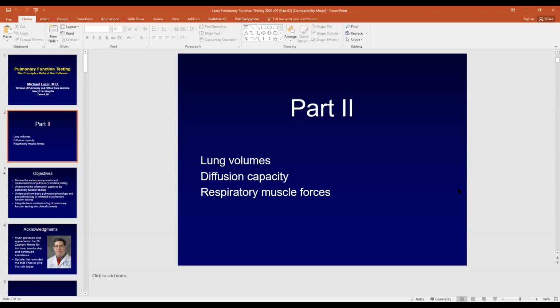So the other question is, we use the airway resistance parameters to help us with the diagnosis of, let's say, emphysema, COPD, and so on and so forth. Has this been looked at for evaluation of central airway narrowing, such as tracheal stenosis? We typically look at the flow volume loop, and we look for blunting of the inspiratory or expiratory loops. But did we look at the airway resistance as a physiologic measurement, whether it indicates the degree of stenosis and helps us with monitoring and follow-up?